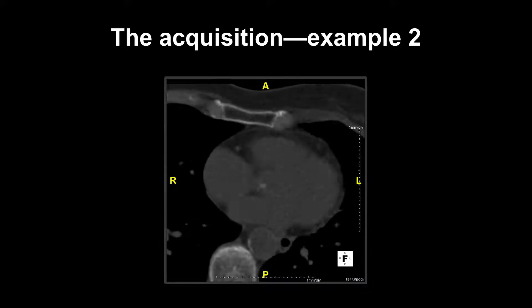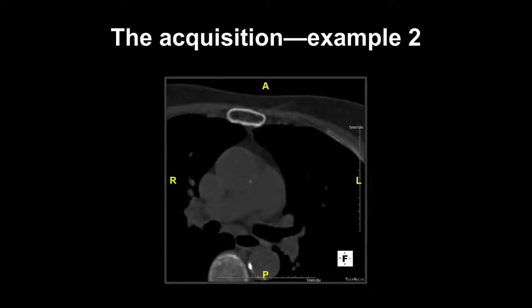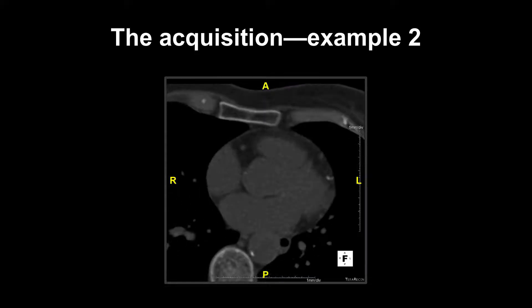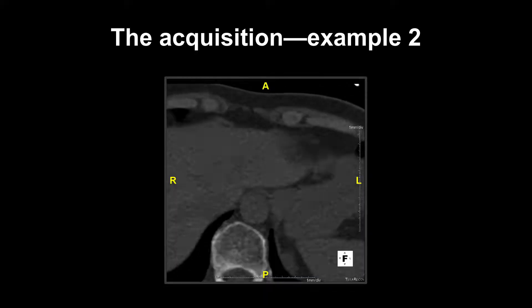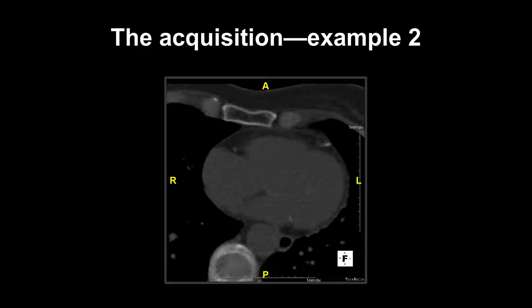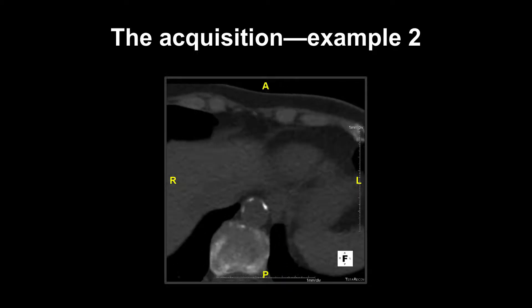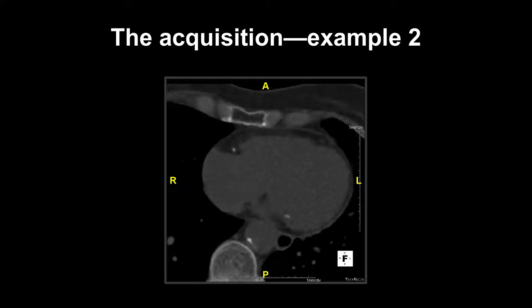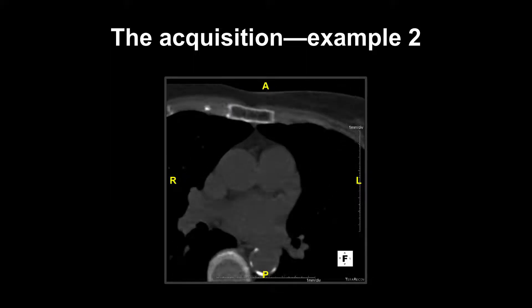This is an example of a patient who has calcification present in all three of their coronary arteries. There is calcification present in the left main stem, proximal and mid LAD segments, the first diagonal branch, the left circumflex, and the mid-right coronary artery. You can also see calcification in the aortic valve and the descending aorta.